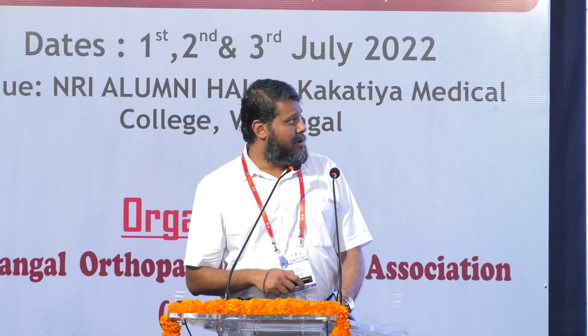Again, the lateral views have been talked about. You look for any dorsal displacement of the carpus, the so-called spilled teacup sign of the lunate, and all of these put together, along with the clinical examination and the history, it's very unlikely that you'll miss a diagnosis now that you know what to look for. So I won't belabor too much on this because this is beyond the scope of this talk.